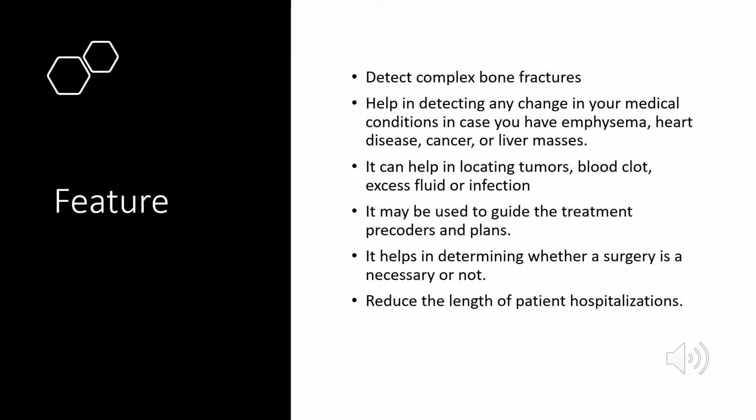Also, as we can see here, it detects complex bone fractures. It helps detect changes in a medical condition. It helps locate tumors or blood clots. It may be used as a guide for treatment procedures. It helps detect whether surgery is necessary or not, because we can see exactly what's inside the body. It reduces the length of the patient's hospitalization. Those are the features of the CT scan.